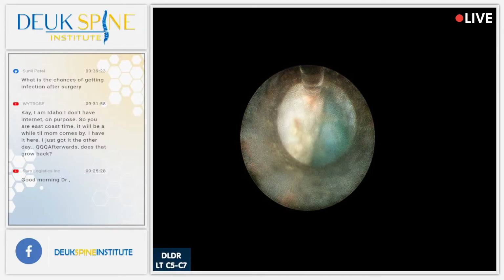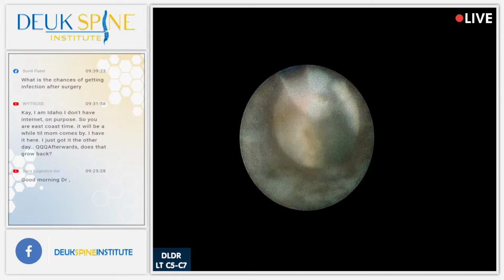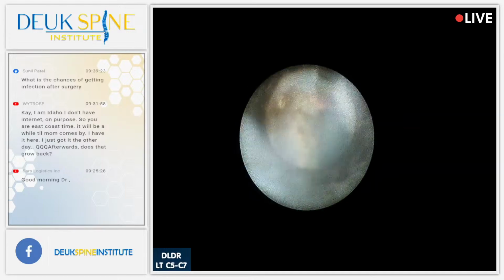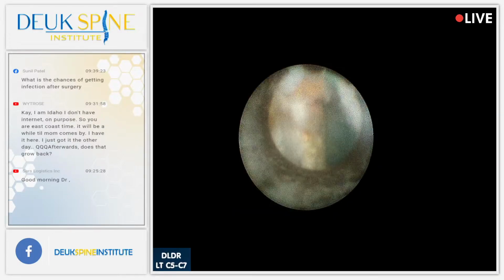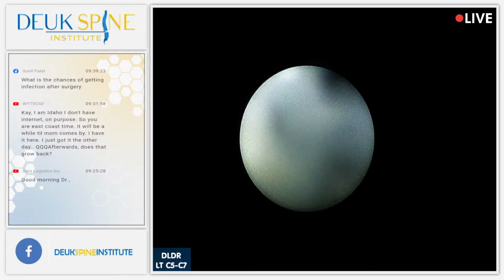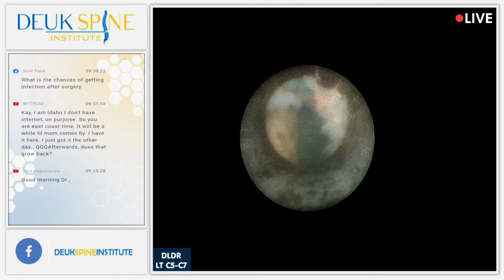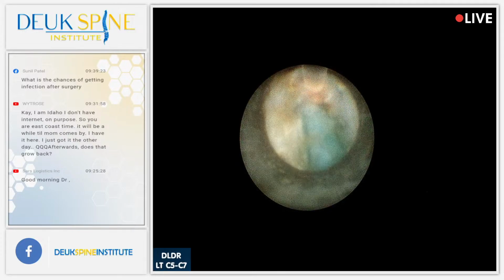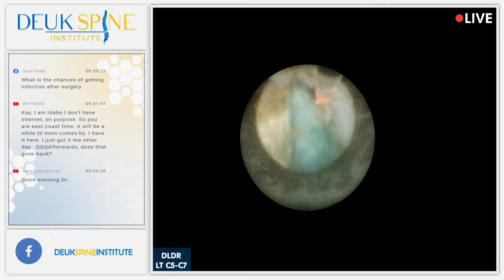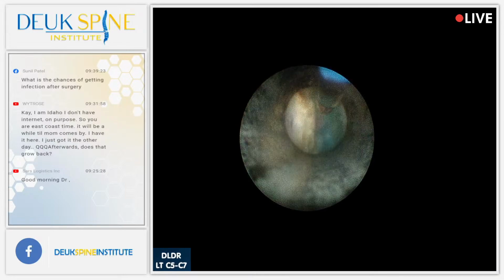All right, we're done in 1 minute. Just want to clean this last bit of tear right here. Now, if you have questions, feel free to type them up. I'm going to come and answer them for you face to face. And I'm very happy you guys are watching, but we're just about done with this Deuk laser disc repair cervical, which is the neck, for 2 herniated discs, the 2 most common to be herniated, C5-6 and C6-7.